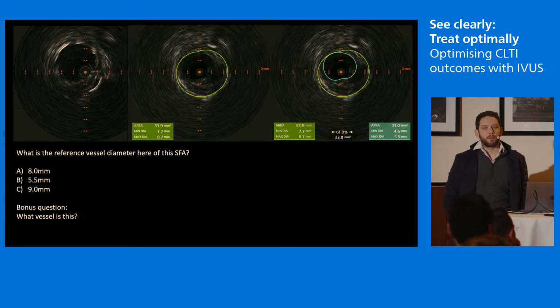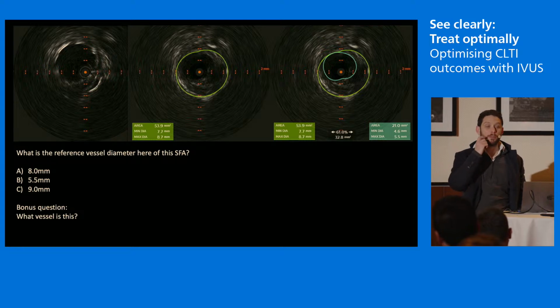So the question here is, there's a maximum MLA benefit that you get. The study shows that if the MLA goes above 18 or 19, the risk of restenosis doesn't reduce.